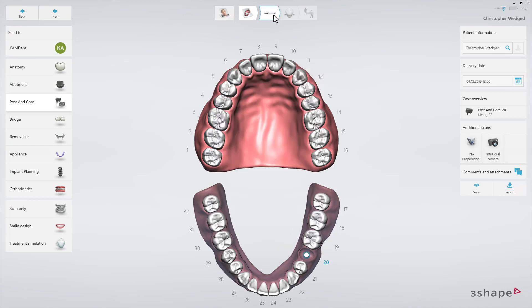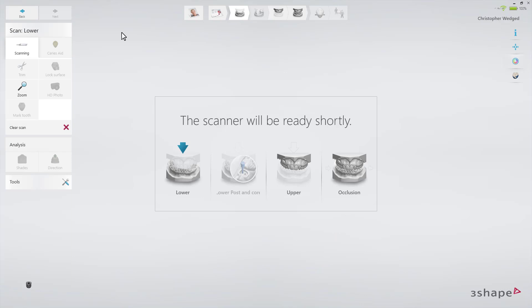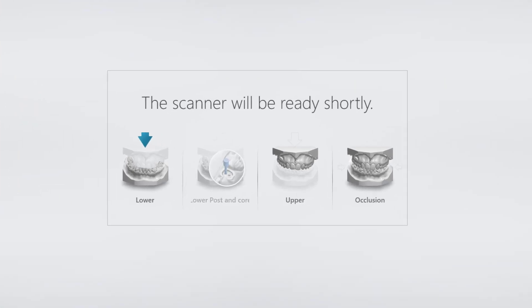Now proceed to the scan page, where you'll have to make 4 scans: lower arch without scan posts — this will be the master model — lower arch with scan posts added, the antagonist which is the upper arch in this case, and then the bite.